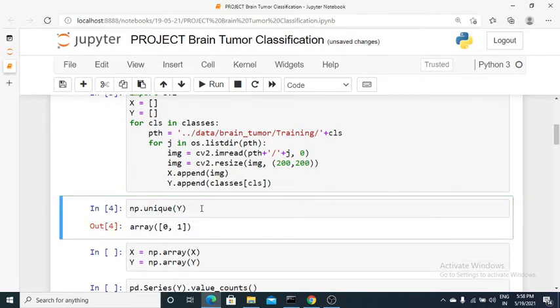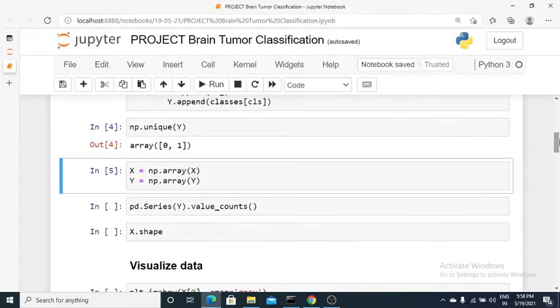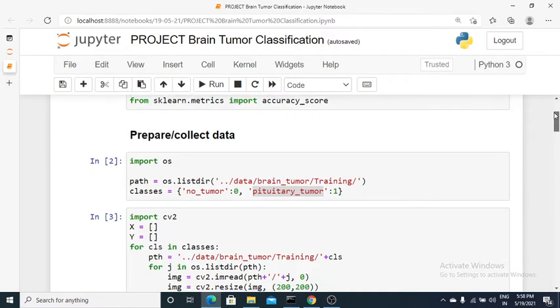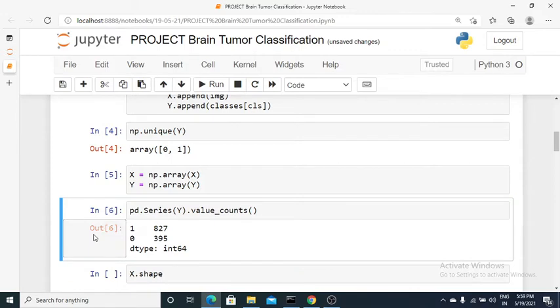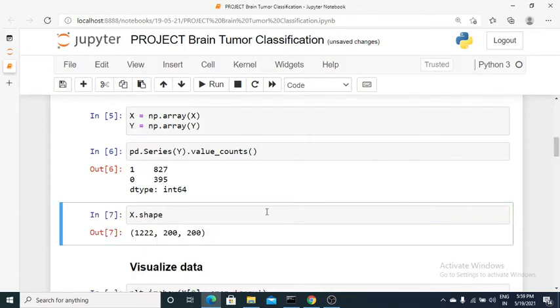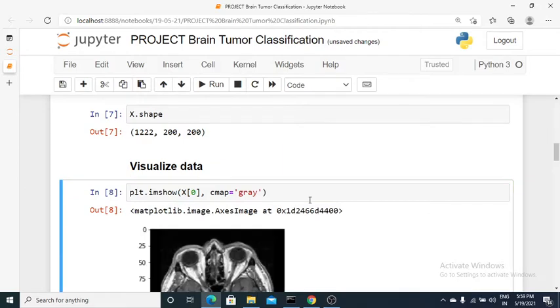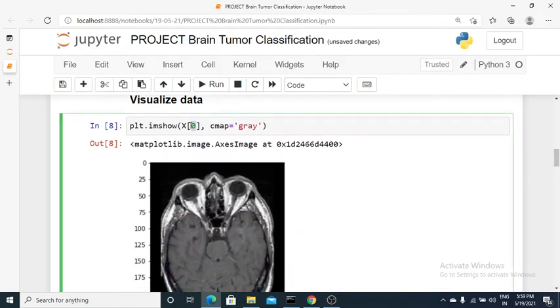I've converted the lists into numpy arrays. You can check the unique values — there are two classes: 0 and 1. Using value counts, there are 395 MRI images with no tumor (class 0) and 827 images of patients with a tumor (class 1). The overall shape is 1,222 samples each with dimensions 200 by 200. You can also visualize any image by index — here I'm checking index zero.